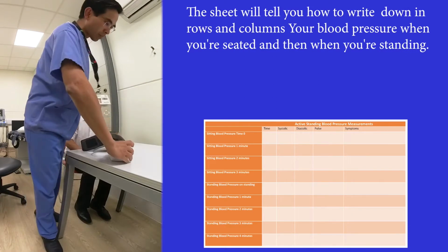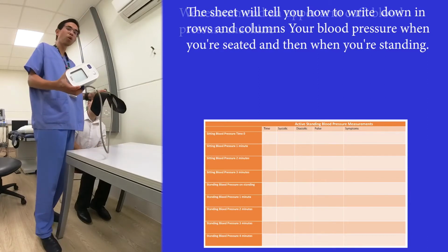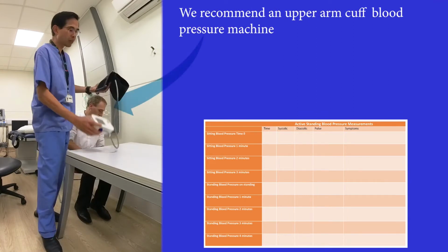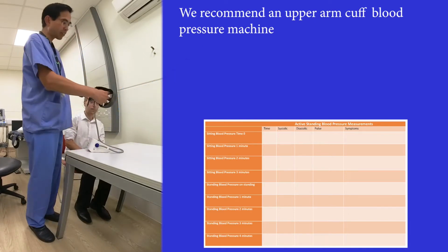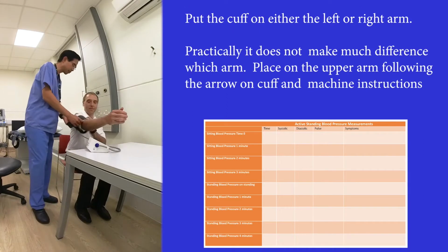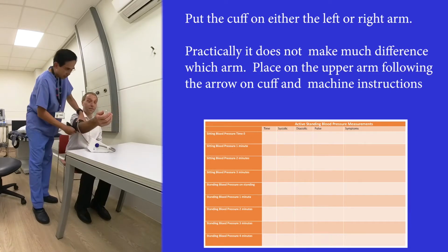What you will need to bring to your doctor is a blood pressure machine. And we always recommend an upper arm cuff blood pressure machine. This is something which looks a bit like this, and this particular model is an Omron. We have a cuff that I'll ask Phil to put on his left hand, it can be any hand, and we'll put it across the upper arm like this, nice and tight.